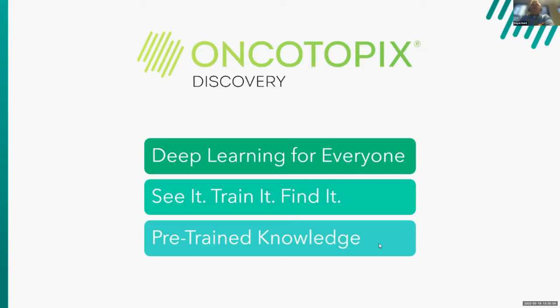As we have more and more experience with this deep learning technology, we are starting to create some pre-trained algorithms that can be used. Now, as I said earlier, we're focusing on cancer biology, so a lot of our pre-trained algorithms focus on that. However, you can literally train the software to find any of the different types of structures, whether they be macro structures in the tissues that you're looking at, or cellular and subcellular structures.